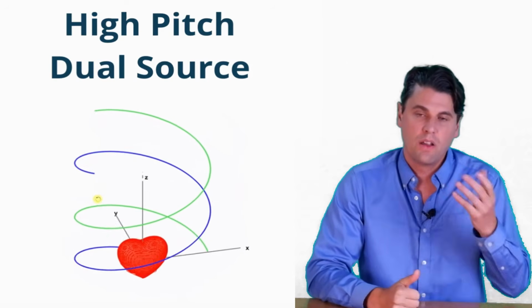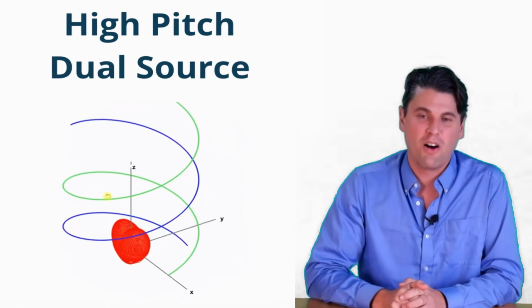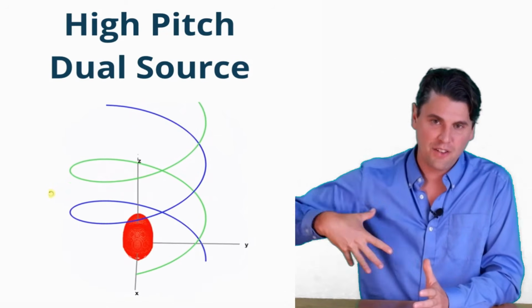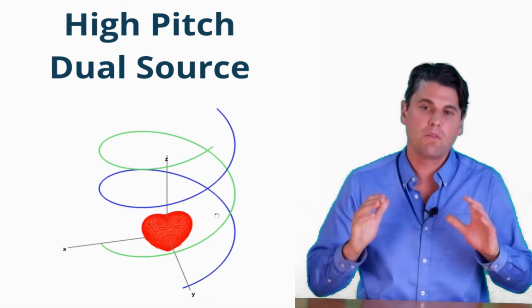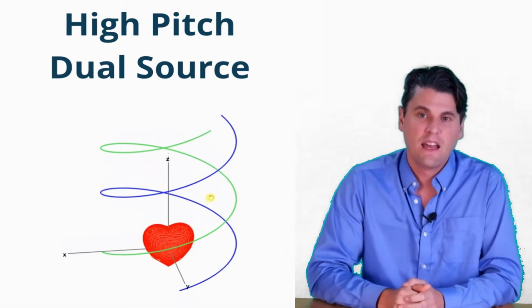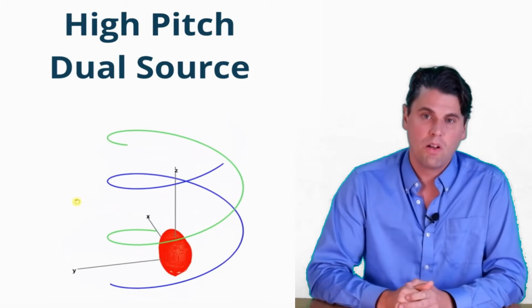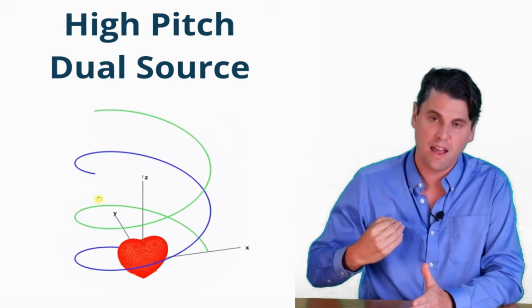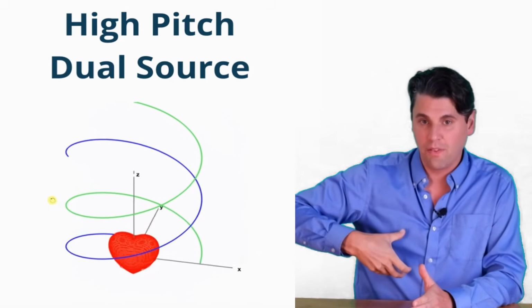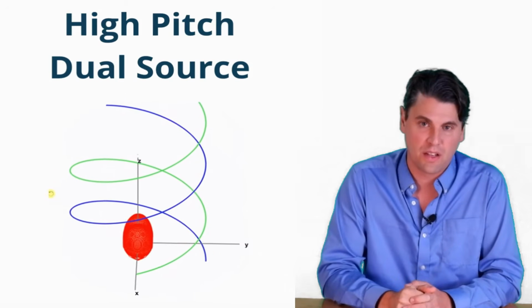So in this scenario, the Siemens Healthineers have introduced what they call the turbo flash, and they have a flash mode specifically for cardiac, where you can do prospective gating. If the heart rate is relatively stable, you can actually gate so that you have the table motion starting ahead of time, and then you will image the volume using this high pitch helical acquisition.